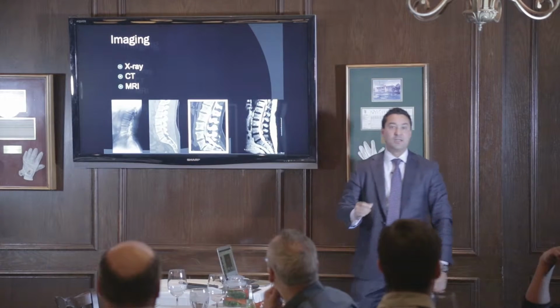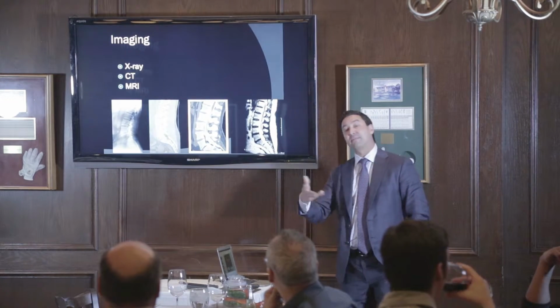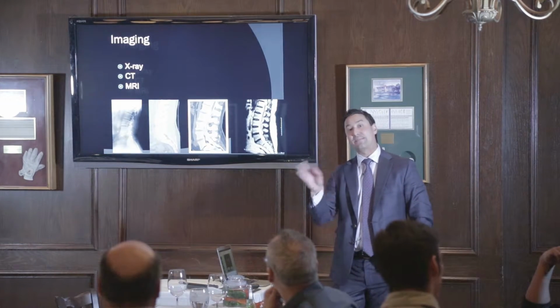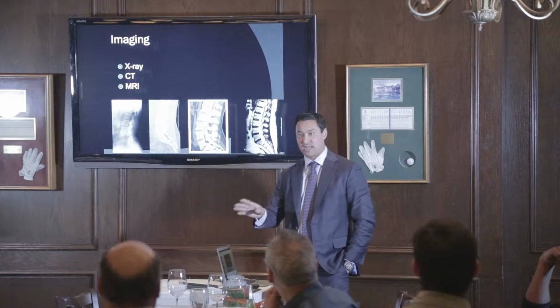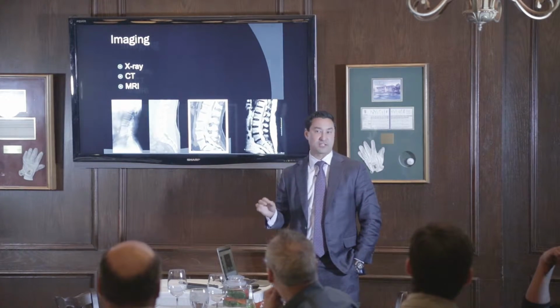So imaging. A lot of times patients come into my office and I have them get x-rays. All new patients get dynamic x-rays, flexion extension. If they already have flexion extension, then I don't. But typically, 9 out of 10 patients will not have flexion extension x-rays.